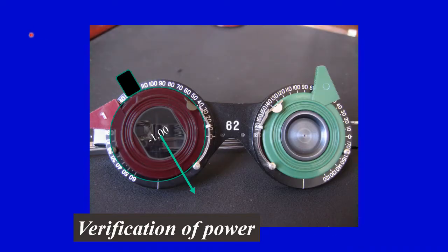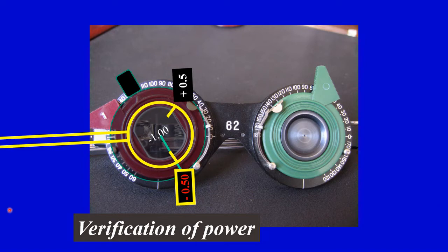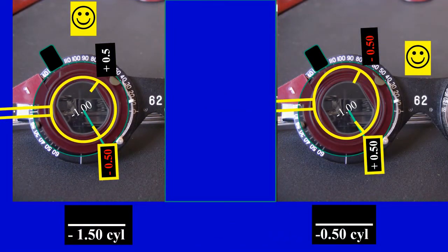Suppose this is the axis we came to and we want to check the power. Now we are going to apply the cross cylinder in such a way that the power of the cylinder of the cross cylinder is in line with the axis tested. This is the first position and I'm flipping. Suppose the patient told us that he sees better with this position. In this case, we are going to increase the power of the cylinder from -1 to -1.5. If he chooses the plus, that he sees better, then we are going to reduce the amount of the cylinder. And instead of being -1, it will be -0.5.